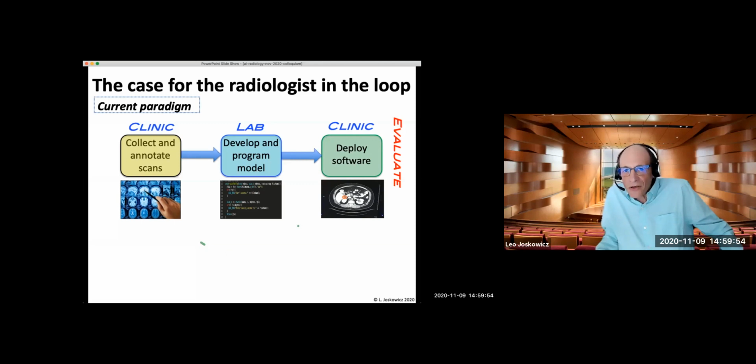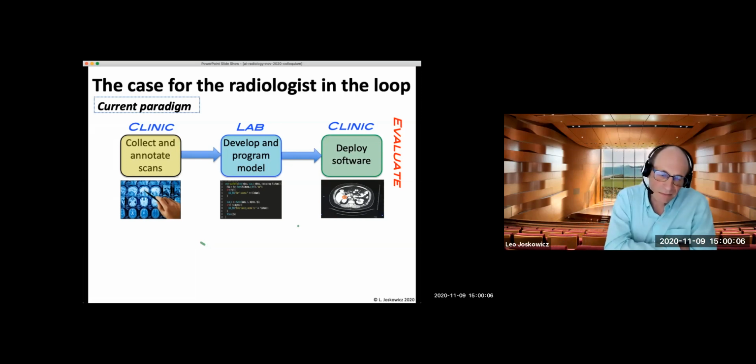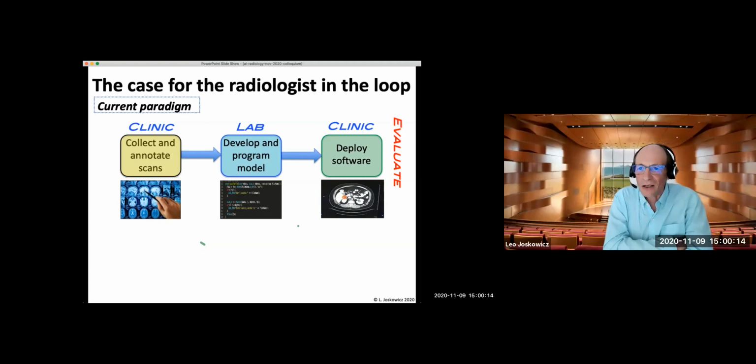There is research on that, but especially for the segmentation part, it doesn't produce very good results. It doesn't mean it's not going to work in the future, but it's still under investigation. The bottom line is you still need some annotations and a way to identify the rare cases.